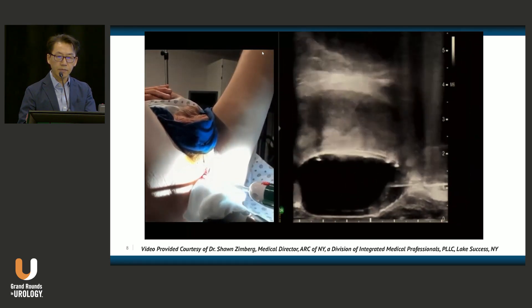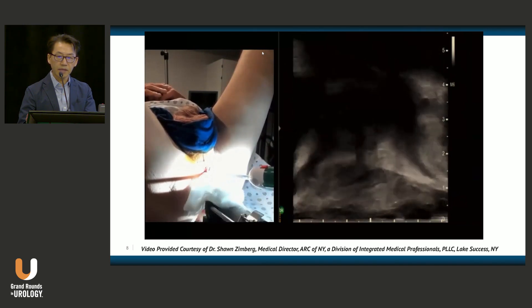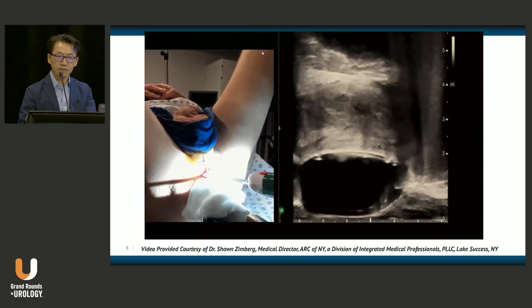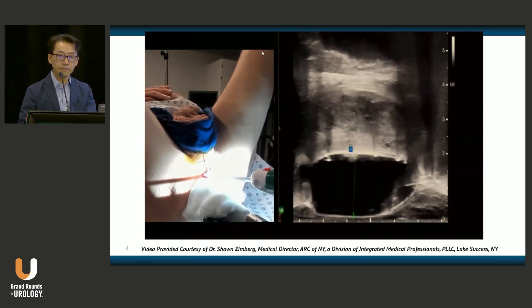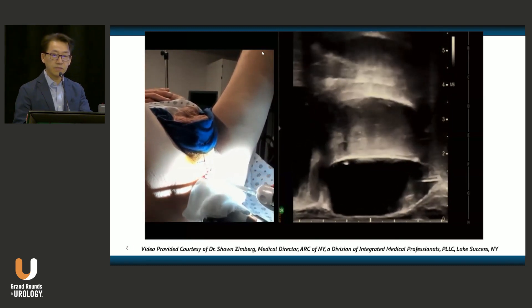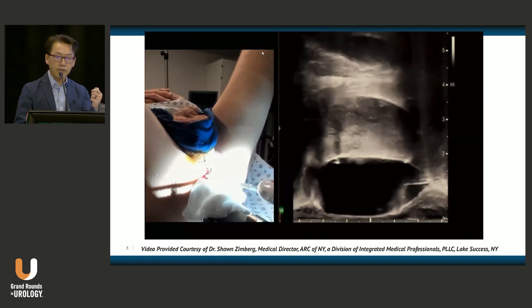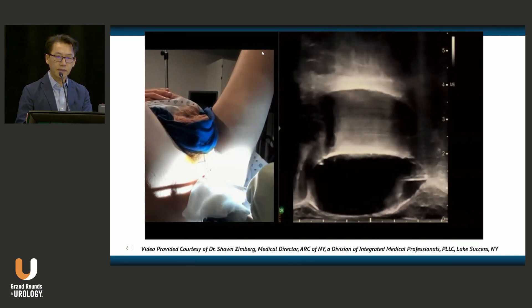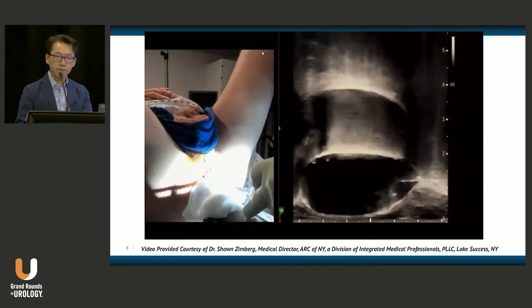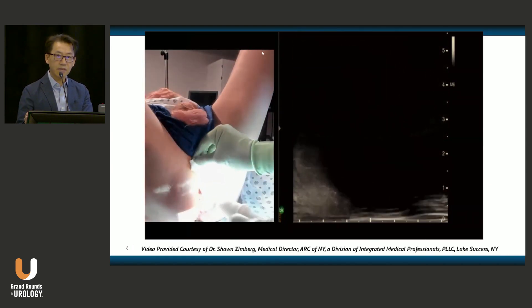Next is a sagittal view confirming positioning, and a measurement can also be taken. This shows approximately 17 cc of saline that has been inserted. Once confirmed and the position is satisfactory, a locking procedure seals the end of the balloon so that saline is locked in place, and then the applicator is removed.